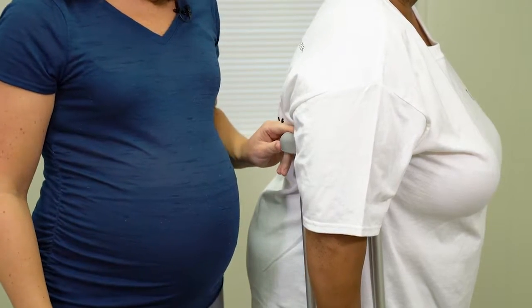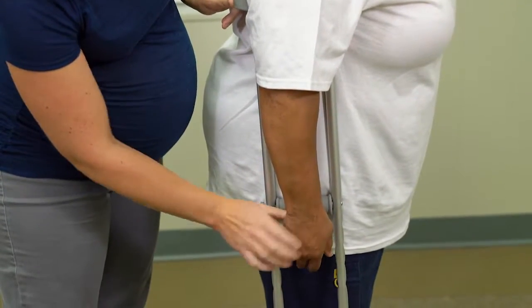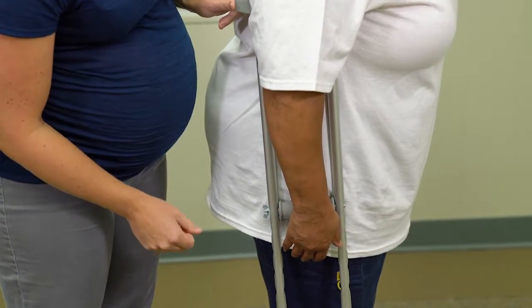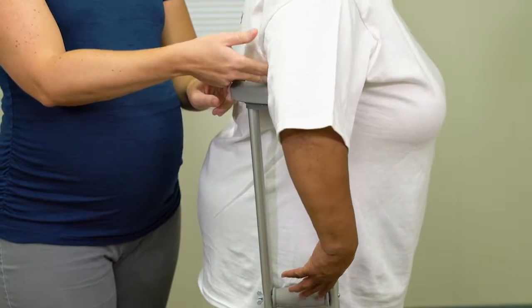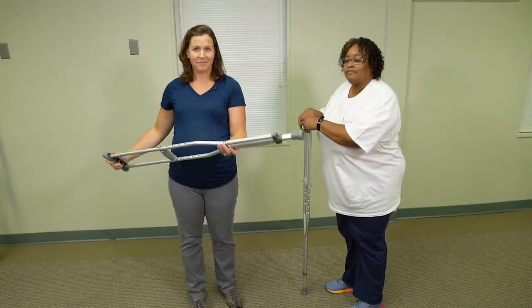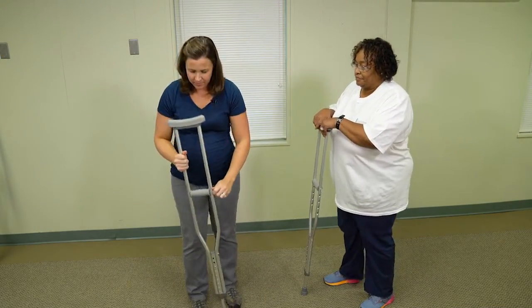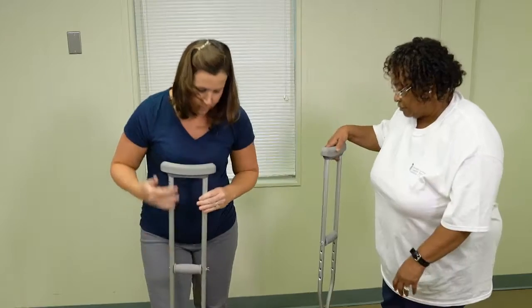So when the arm is down by the side, you want to make sure that where the wrist bends is at approximately the height of where the handle is on the crutch. And the height of the crutches should be about a 2-finger space between the top of the pad and the armpit. After you get the first crutch sized, you want to make sure that you get the other crutch sized to the same height so that when you're walking, things are comfortable.